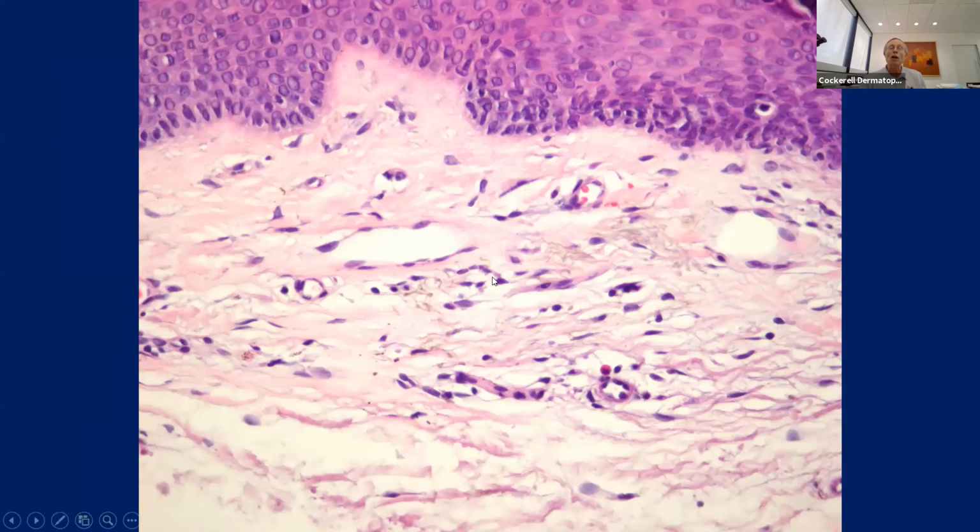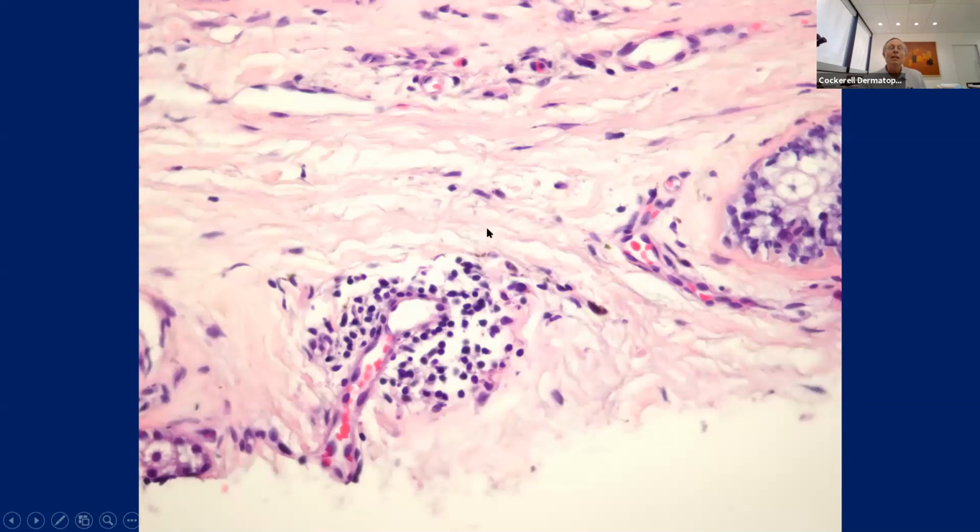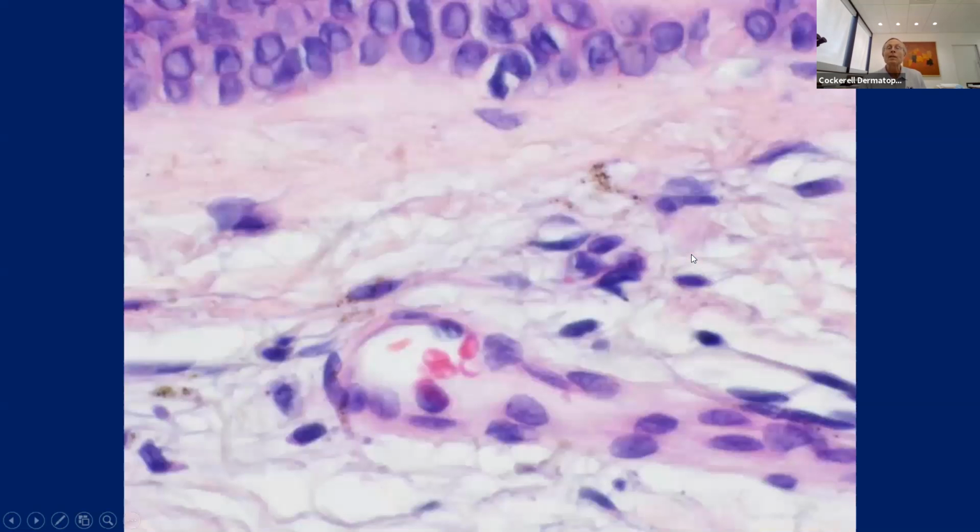There's something kind of dark here. And you go to higher magnification, you've got this little dark brownish black material here. You've got this kind of granular material on these little structures here. And maybe some of them are also present over here near this, it's probably a little sweat gland over there. And we've got these little granular particulate structures, and notice where they're located. Yes, they are staining the actual elastic fibers. So yes, somebody has put the right answer in here. This is argyria, cutaneous argyria.